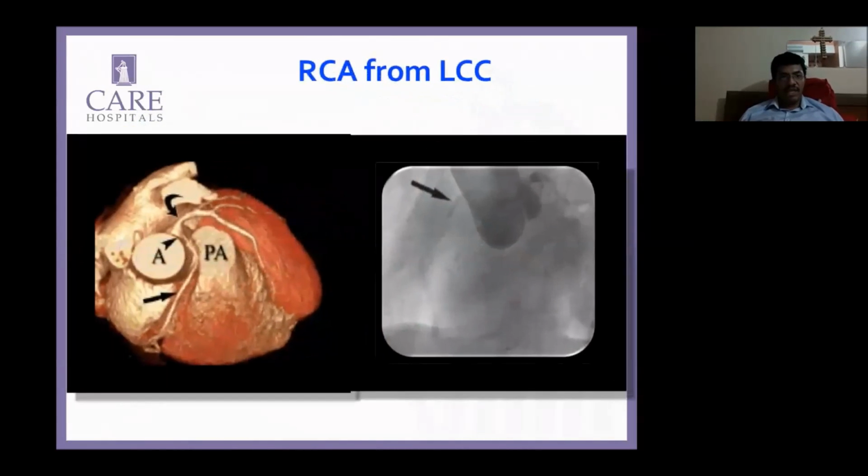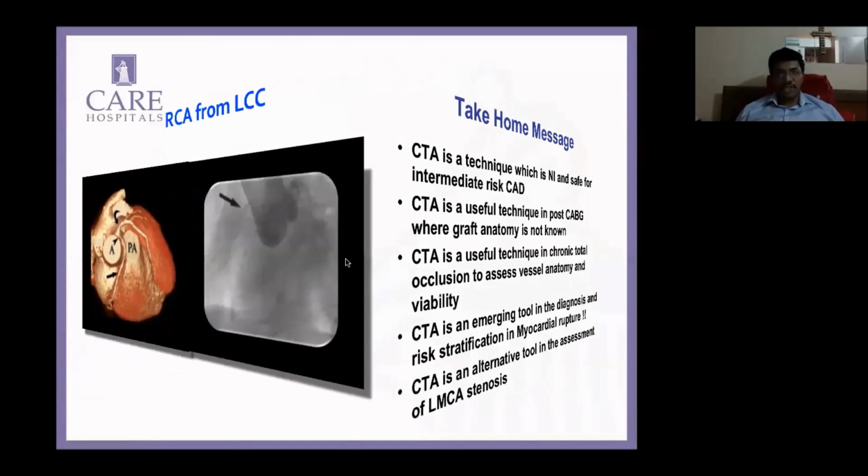And this again is another patient from our series where this is the angiogram. Actually, a root angio was done. Really couldn't make out. Obviously, we didn't follow Sharat's method. And that's the faint outline of the vessel that you could see. And very beautifully, this patient has this right coronary coming from the left cusp, snaking between both the great arteries and going down.